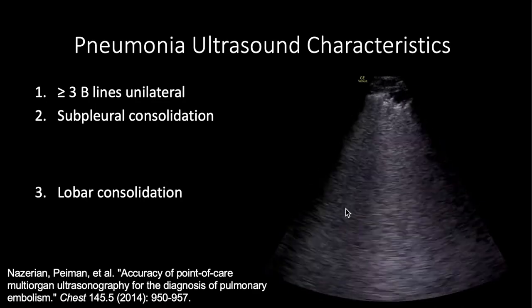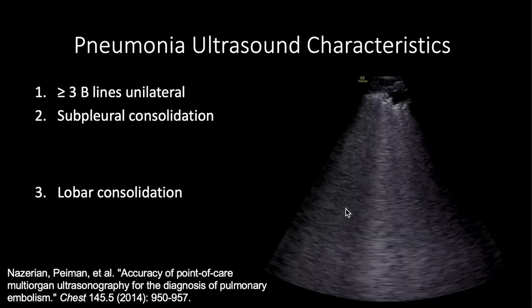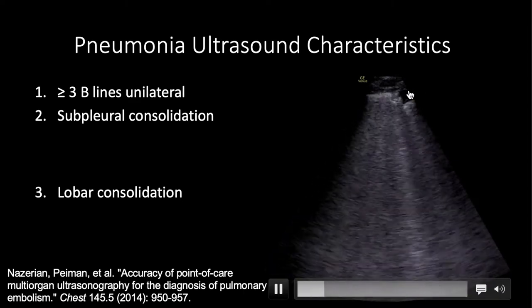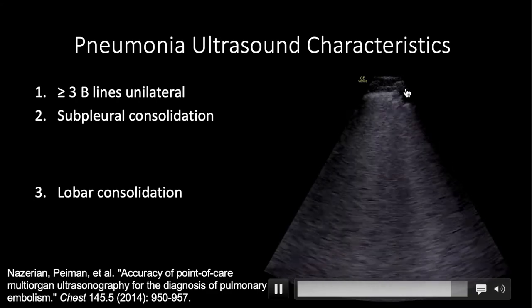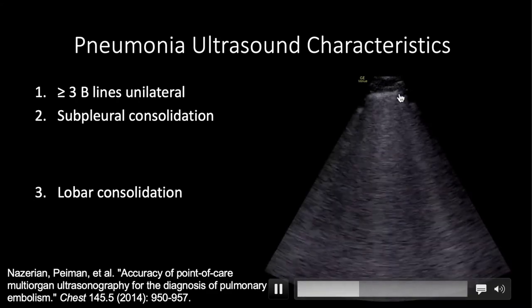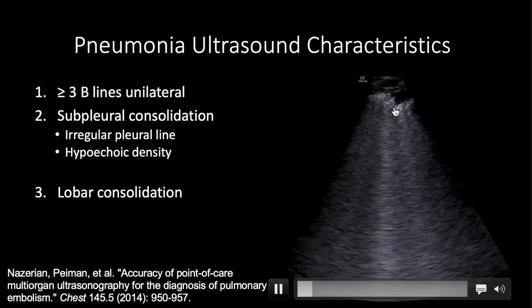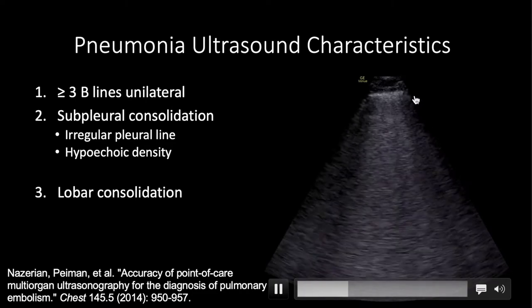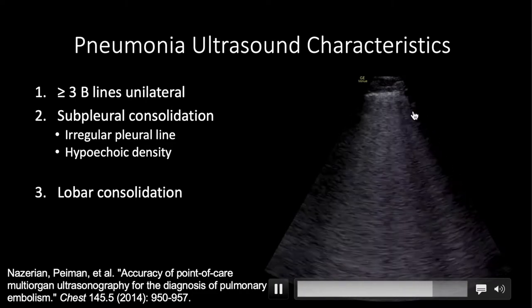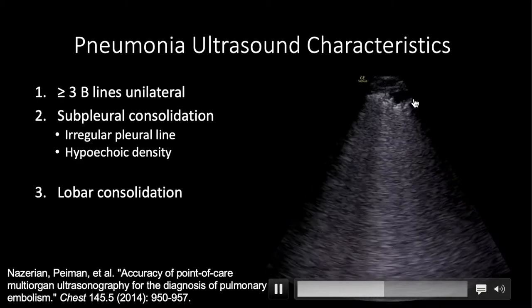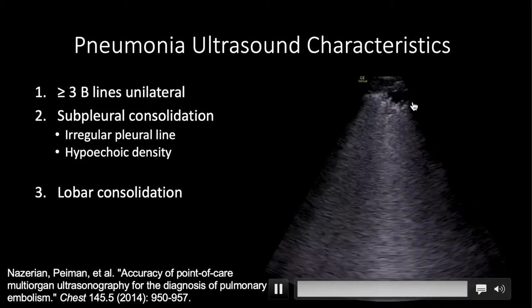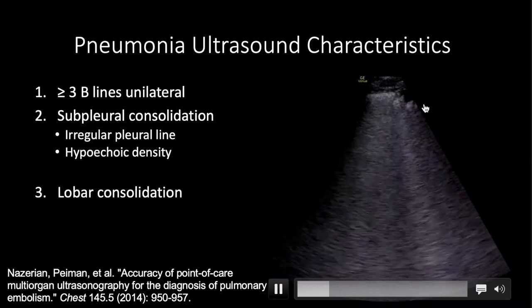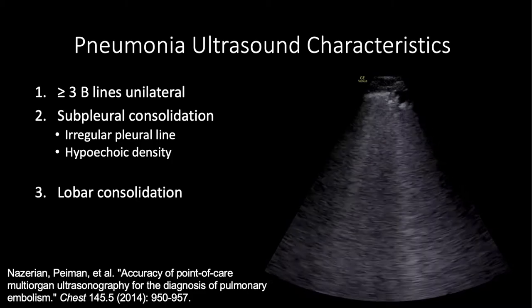Let's talk about subpleural consolidation, which increases our specificity for pneumonia. Normally your pleural line is white and goes across the screen, but here the pleural line is interrupted — there's a hypoechoic or black spot up against the pleura. This irregular pleural line and hypodensity is due to pus starting to fill the lung, making it behave more like a solid organ, with B-lines arising from it. This doesn't happen with CHF — it's an inflammatory infiltration.